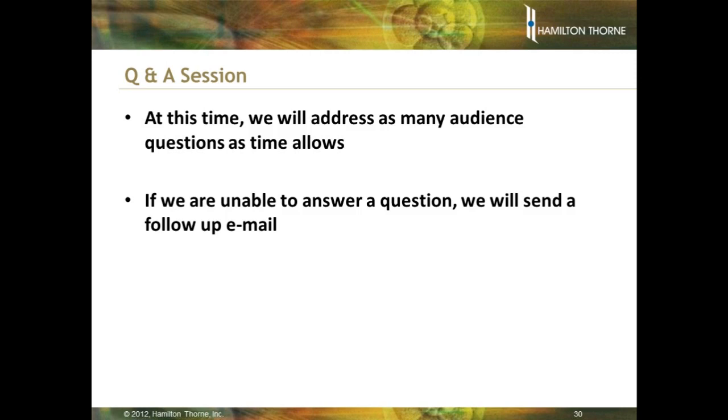Great, thank you. This could be for Dermot as well. How often should we calibrate the scale to measure the size of the hatch site? Well, the scale can be calibrated just with a reticle which is on the microscope, and it won't change, but I would recommend for good practice that you should calibrate it once a week. You'll usually find it hasn't changed at all. I can tell you our calibration has never changed in 7 years or more than that. Exactly. That's a good point, Dermot. It doesn't change.